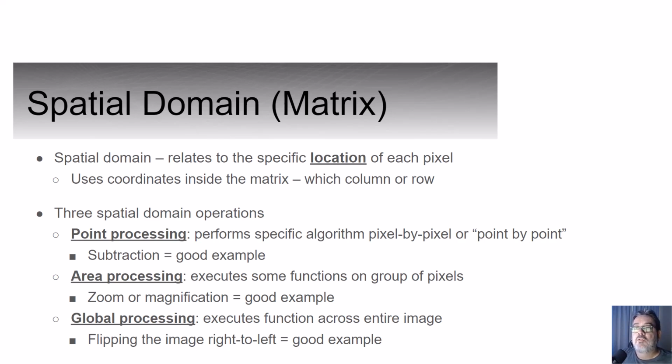However, if you perform that same PA chest X-ray using the same technical factors at the console, but you select the PA hand algorithm, the image would look much different. The hand algorithm, or any orthopedic algorithm, is going to be designed to be high contrast, to place emphasis on bony detail and not necessarily lung tissue. Selection of the appropriate body part and projection at the control panel assigns the algorithm you need for the appropriate appearance of the finished radiograph.